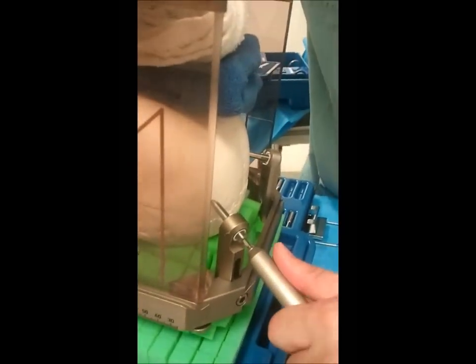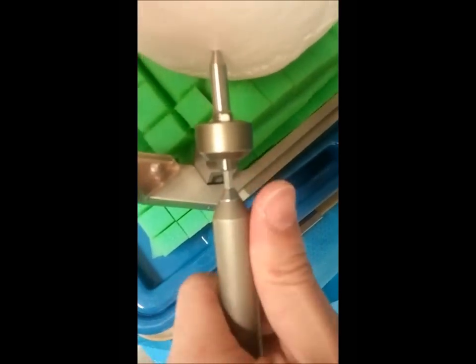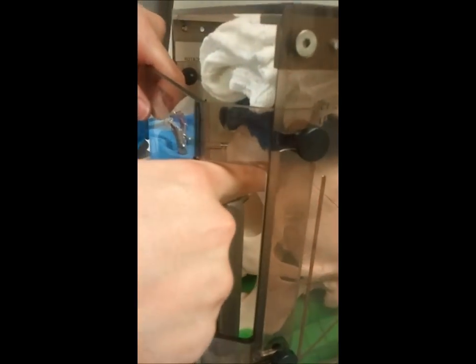Then you come back and get your final tightening. You obviously don't want to violate the inner table of the skull. This feels very nice and tight, and this placement of the screws is ideal — obviously above the orbital bone. You don't want it too severely angled because they'll slip off.